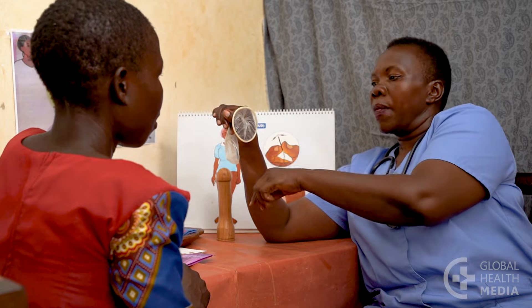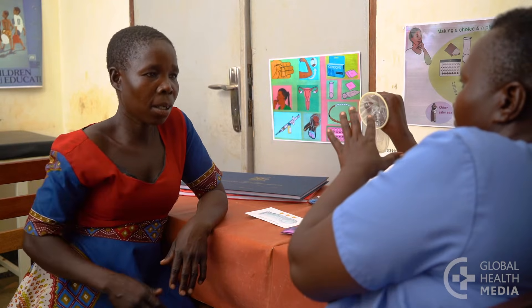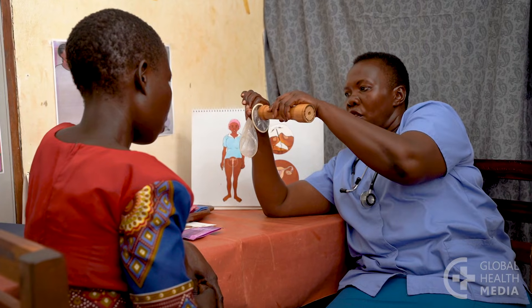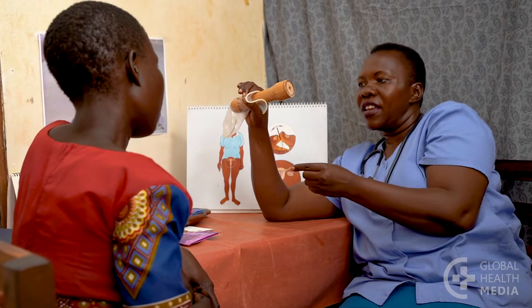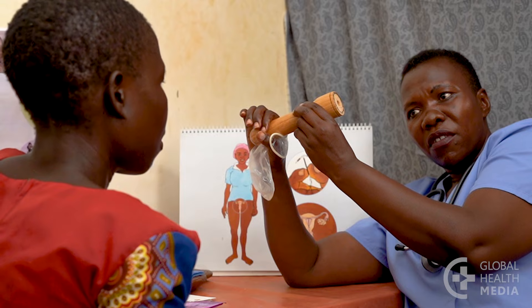Though that may seem a little odd at first, it helps the condom stay in place and protects the woman from sexually transmitted infections. The woman needs to guide the penis through the outer ring. This is important — the penis can slip into the vagina along the outside of the condom and not give her any protection.